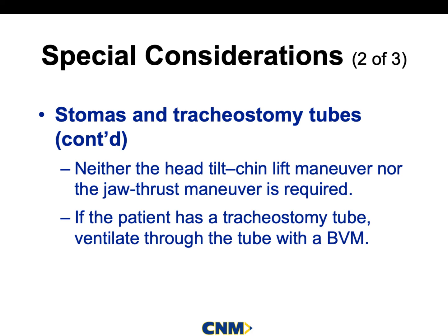And this is the best time, guys, to put the patient to work, right? Especially if this patient's at home with a tracheotomy and they're on a vent, and for whatever reason they need to go to the hospital, right? And they're awake and they're alert, right? And they're looking at you. Some of these patients might not be able to talk, okay? But just because they're not able to talk doesn't mean they're stupid, all right? Give them the bag. Hook up the bag and have them squeeze and tell them, listen, dude, I want you to squeeze this bag every single time that you need to take a deep breath in. Put the patient to work. There's nothing wrong with that.